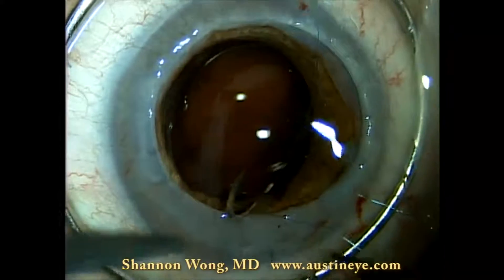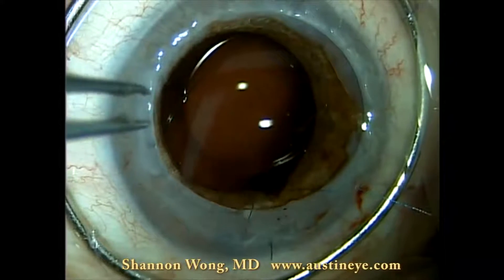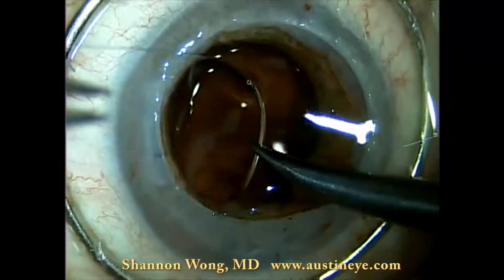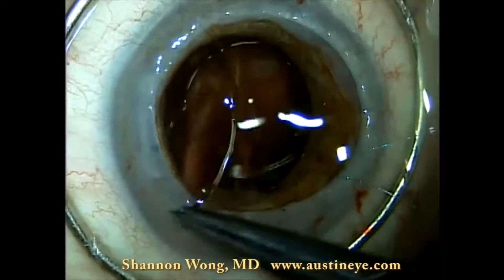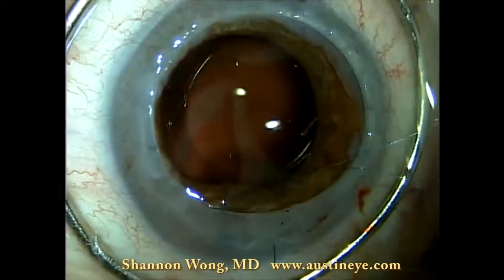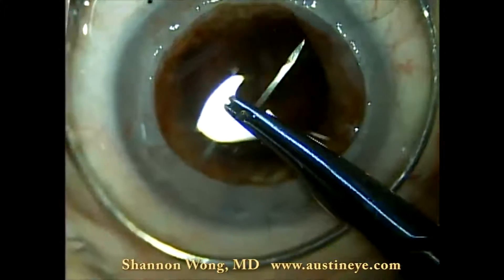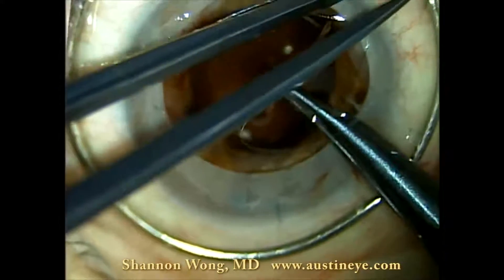For this patient, I used a purse string technique where I went 360 degrees around the pupillary border with my Prolene suture and then tied it. This surgery was presented at the October 2011 ASCRS meeting, where I saw other techniques of pupilloplasty — one in particular using two throws at 12 o'clock and 6 o'clock with Prolene, resulting in a nice narrowing of the pupil with a good cosmetic result. In retrospect, we could have also used that two-point fixation technique to decrease her pupillary opening.